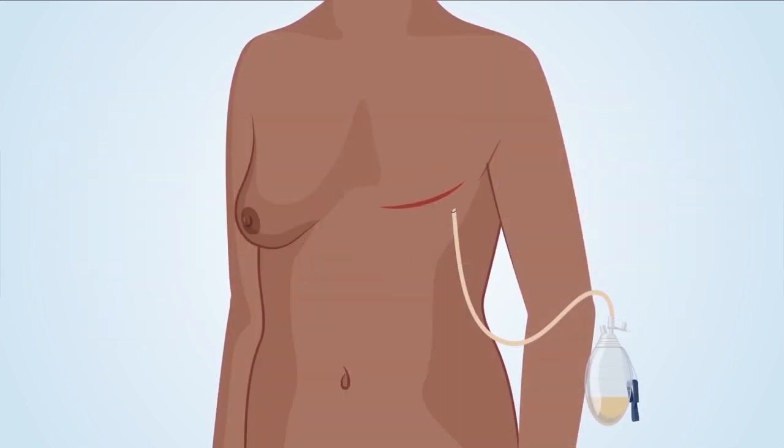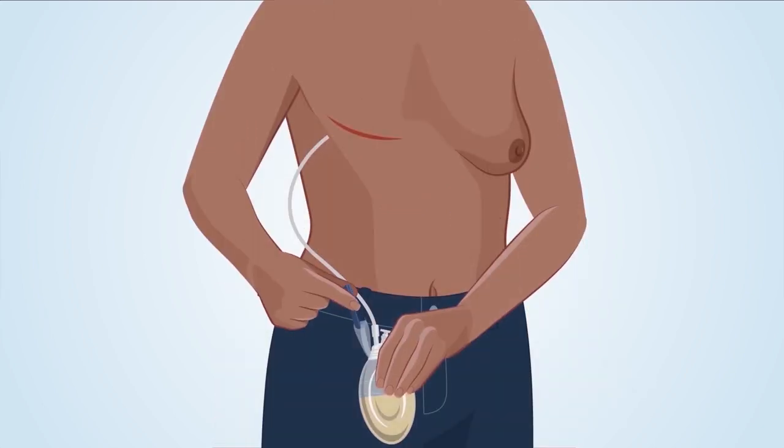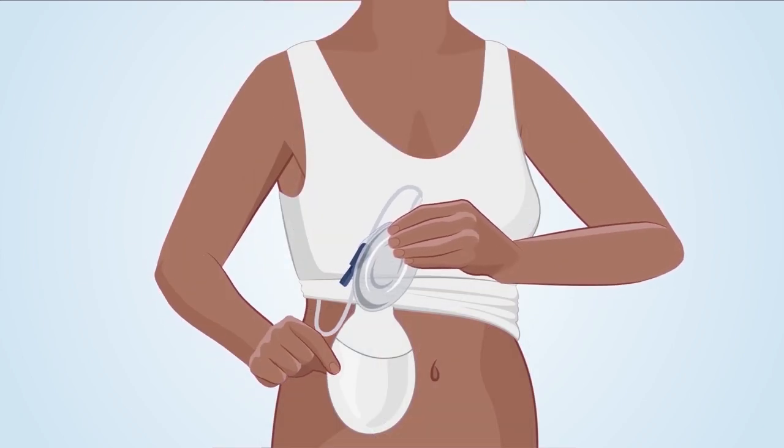The drain removes fluid by suction and gravity. Squeezing the bulb and putting the stopper in creates a constant and gentle suction. The suction pulls fluid away from the incision through the drainage end and into the bulb. By keeping the drain below the cut or incision, gravity works to help drain fluids. This can be done by clipping the bulb to your clothing at waist level, or by placing it inside your post-surgical camisole pouch.